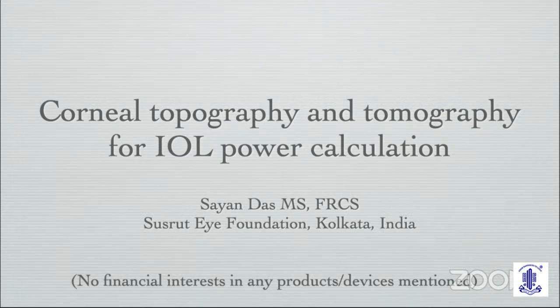Sir, to be very frank, with this tomography and your IOL Master 700, getting such a patient is not so frequent. It is very rare. Only in cases where we have a post-refractive surgery or a patient who's got keratoconus post C3R coming in for an IOL calculation, we see a little bit of difference. Otherwise, with most of the other routine patients who walk in for surgery, we don't see much of a difference here, sir. The number we calculated is very less. Okay, thank you, Dr. Jayanthan.